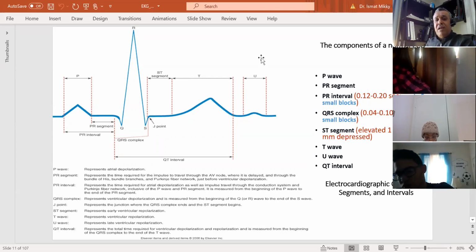In the absence of the U wave, if right after the T wave there is a P wave, then there is no time for the ventricles to fill with blood from the atria. So the filling phase takes place during the U wave. That's the relaxation phase for the ventricles, represented on the EKG strip as a U wave.